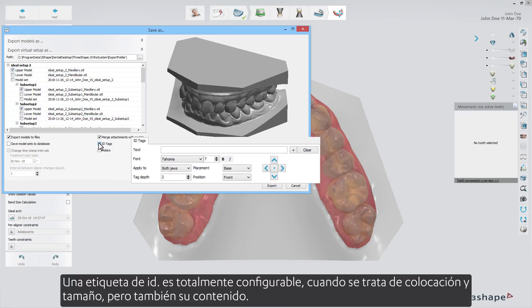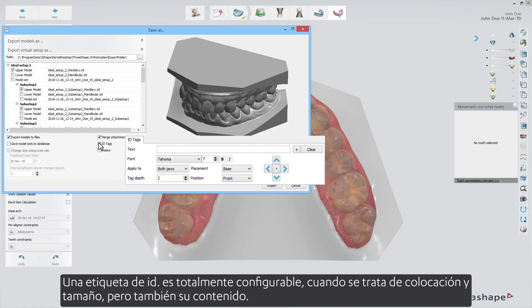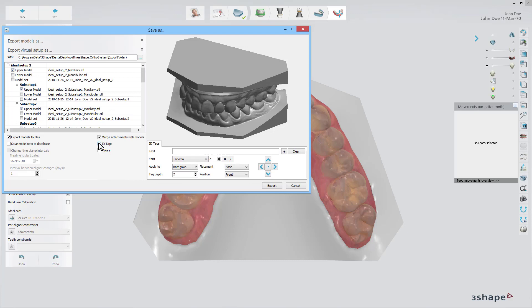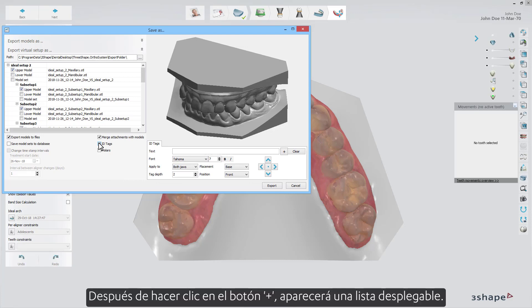An ID tag is fully configurable when it comes to placement and size, but also its content. After clicking the Plus button, a drop-down list will appear.